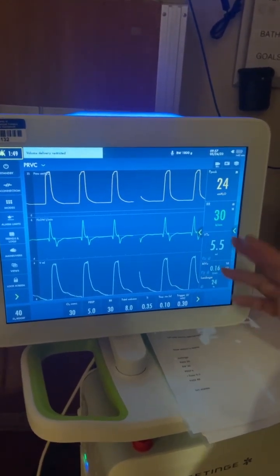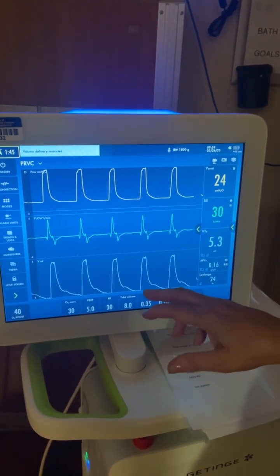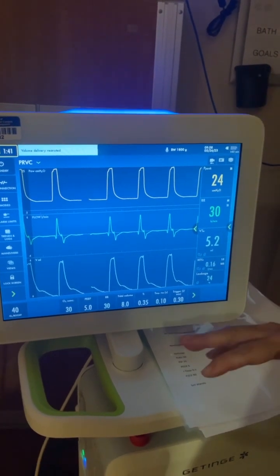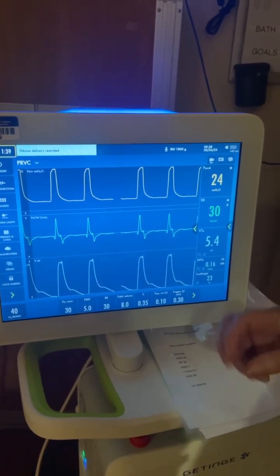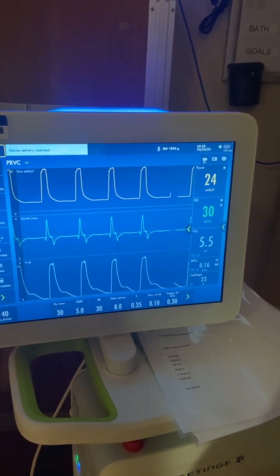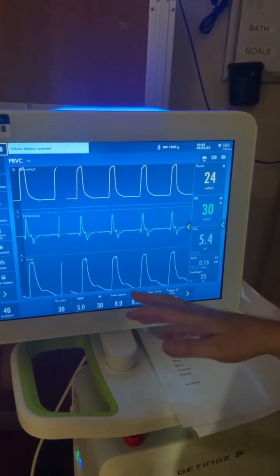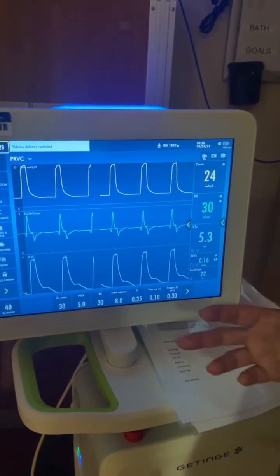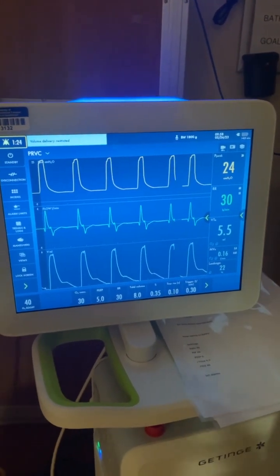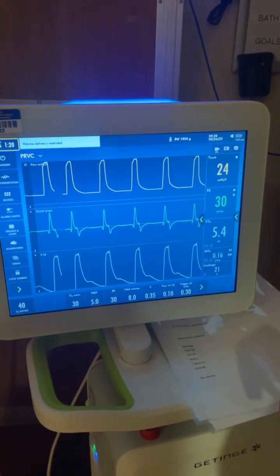So that's the reason people like this mode, the reason your practitioners are going to order this mode, is because of that tidal volume. We never have the risk, like in pressure control, when we set our PIP over PEEP, that if the baby's lungs get remarkably better, they can overventilate and have pneumothoraxes. When you have control of the volume, they can never go greater than this volume. And so that decreases the risk of barotrauma, volutrauma really, and the risk of pneumothorax. So that's what volume control is all about.